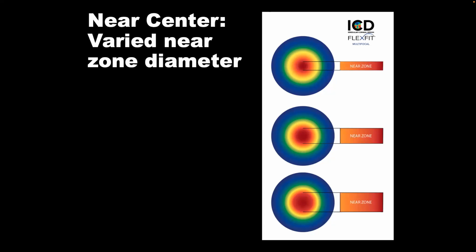And minimum, and this is something said by Dr. Greg DeNaeyer from the United States, just having a good distance BCVA, like 20/25, will do a good fit for multifocal most of the time. And just having those three things will help.